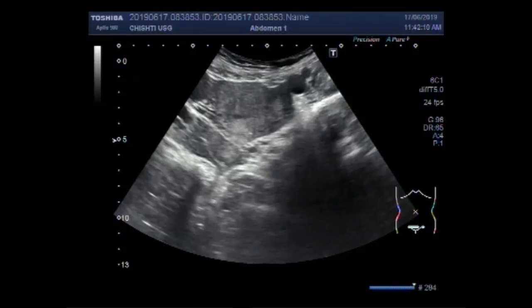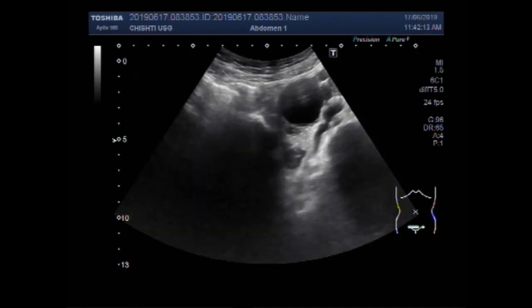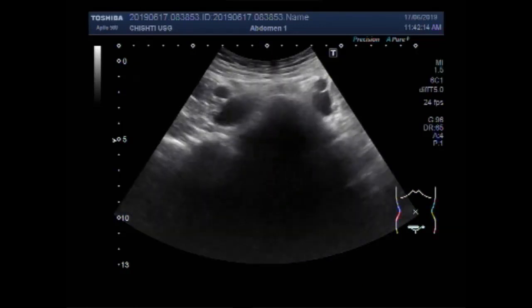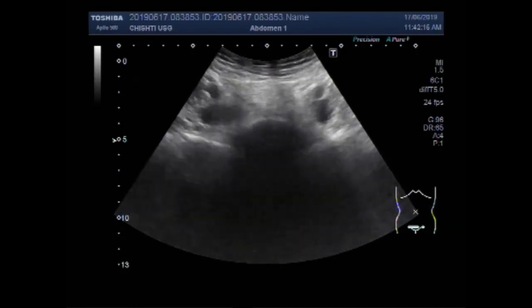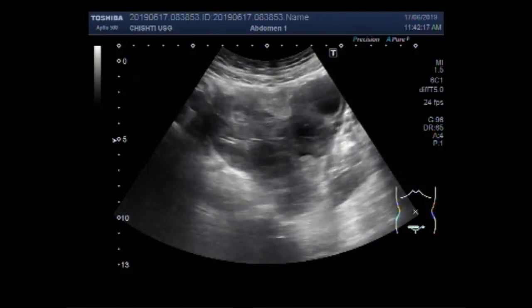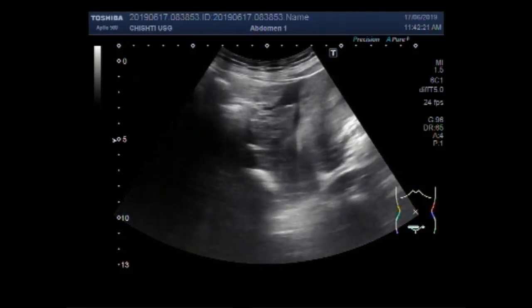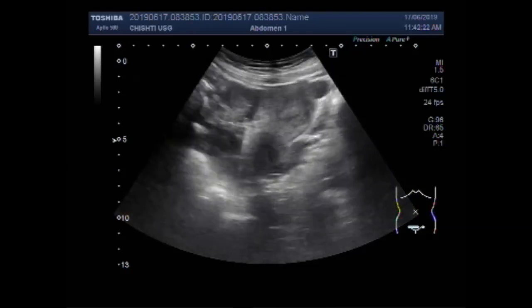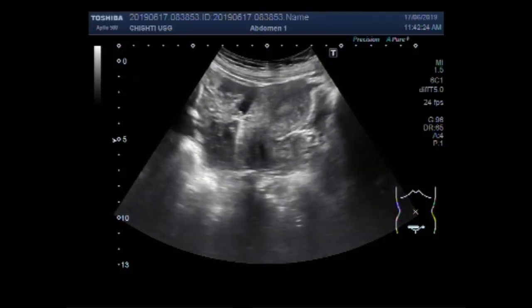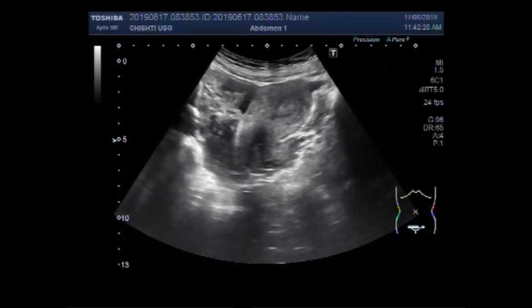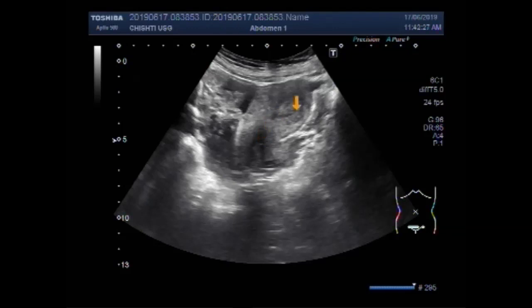Dear viewers, I hope you are all fine. This ultrasound video shows multiple types of ovarian cysts in the same patient. Now you can see the uterus — it is anteverted, it looks bulky and inflamed.